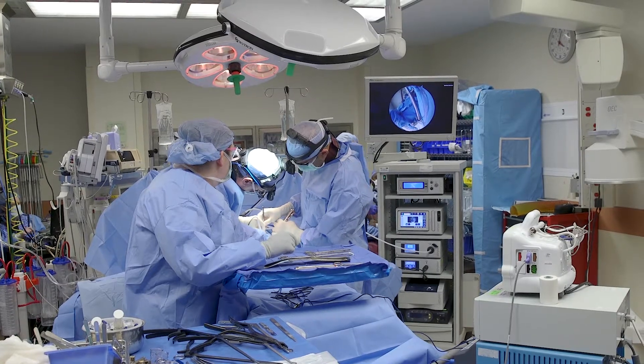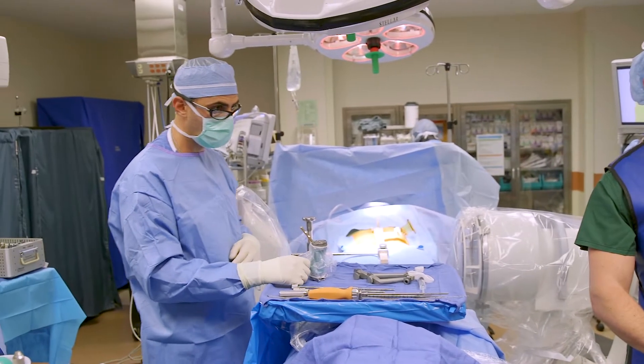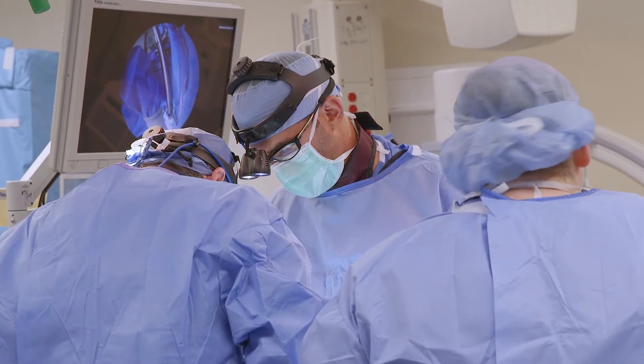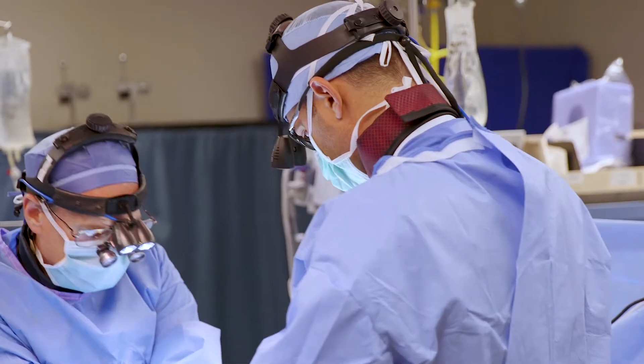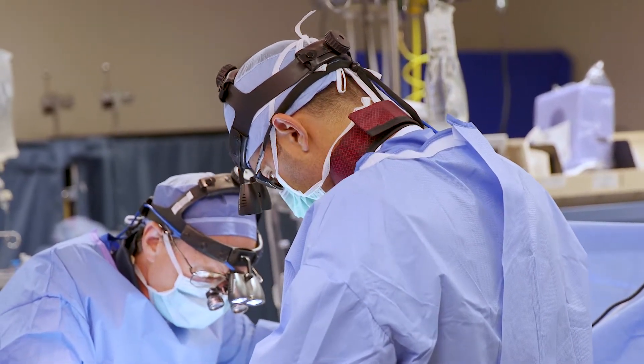If you are truly going to place posterior fixation and you know that your goal is to get indirect decompression of the neural foramens, you place a midline cage, you fixate your blades, you get the patient turned over, and then you place your pedicle screws, interspinous device, interlaminar device — your choice — but you know that you have solid fixation through the front with the least amount of aggravation.